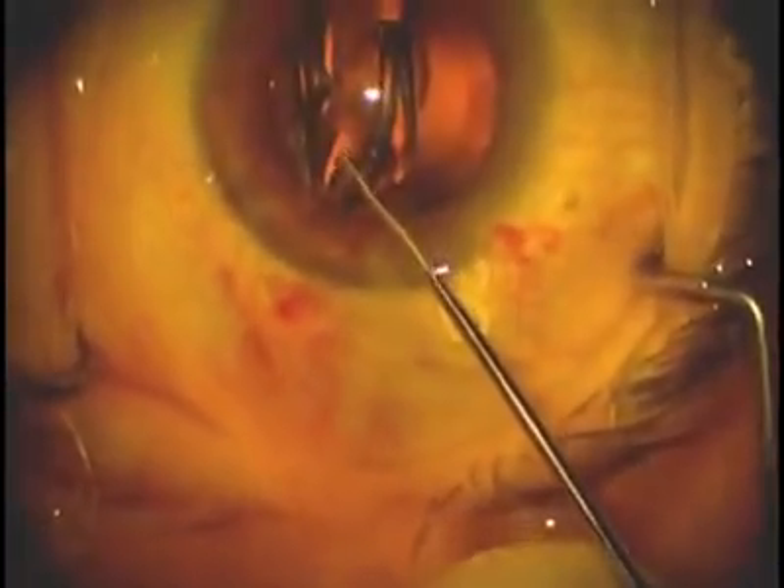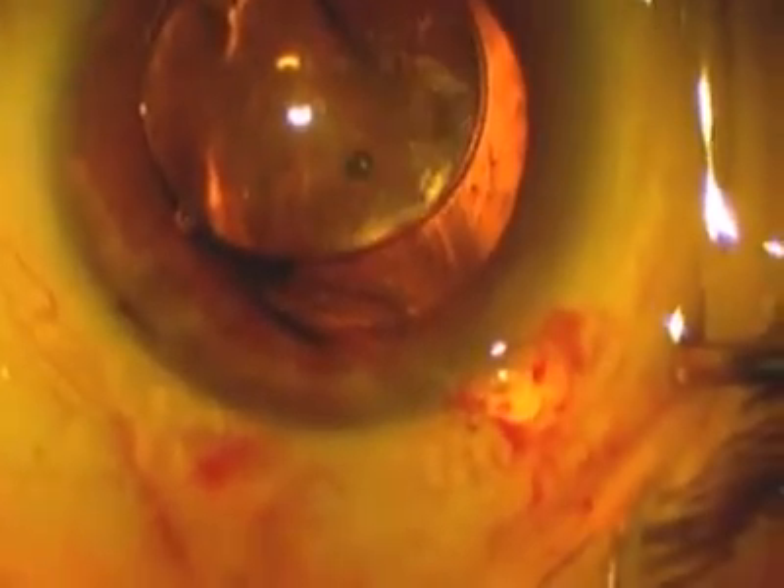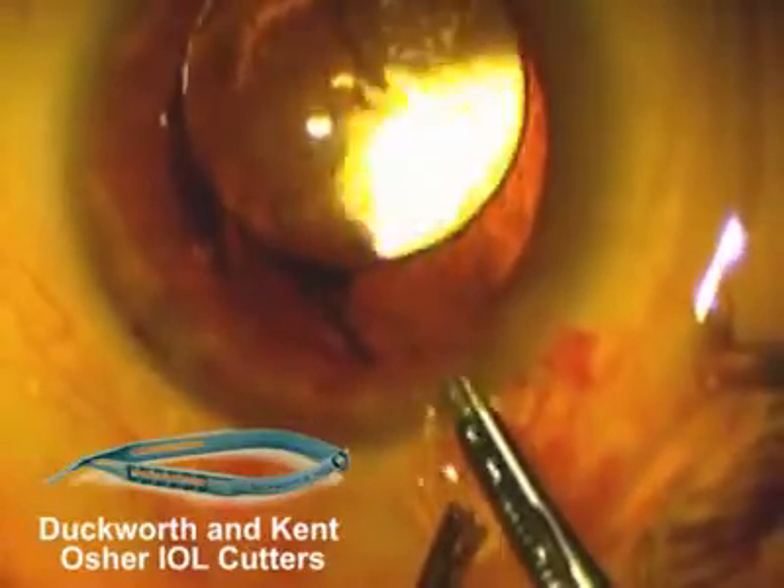Sometimes these lenses will get little mars as you place the lens in, possibly from rubbing on the cartridge. But in this case it was right in the center, so I decided to go ahead and remove the lens.